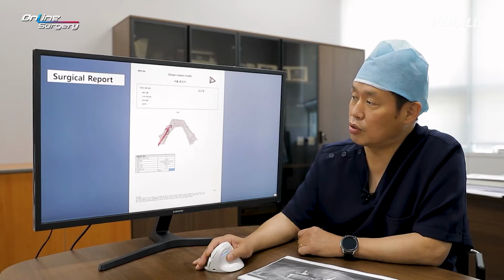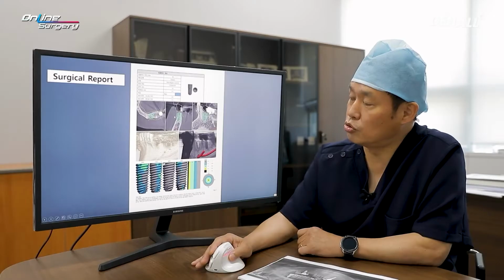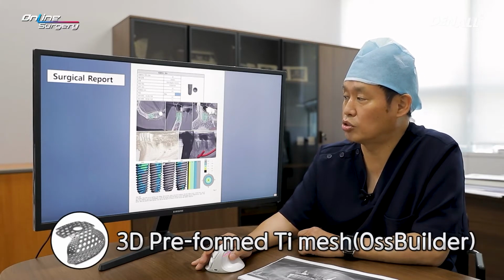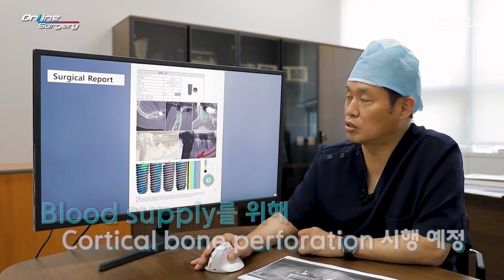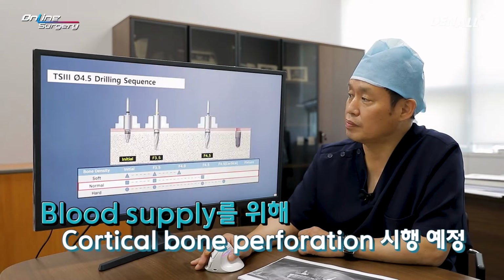Implant Studio is used for anticipation. Because it is a premolar, a 4.5 millimeter implant was planned. For the dehiscence defect, if it is exposed, in order to maintain the volume, I'm going to use a 3D preformed titanium mesh from OSSTEM, the OssBuilder, for GBR. In the case of lower premolar, the cortical bone can be hard. For bone formation, blood supply is necessary, and perforation of the cortical bone will be done.